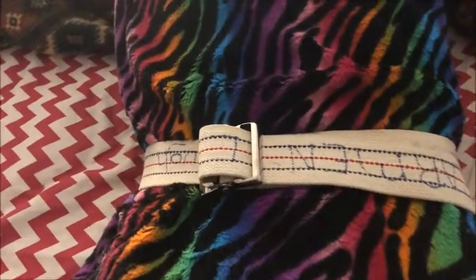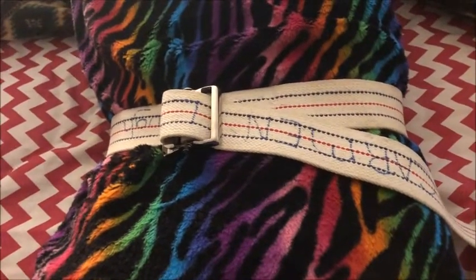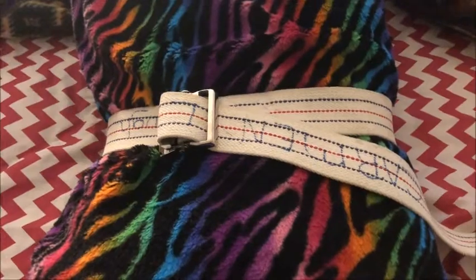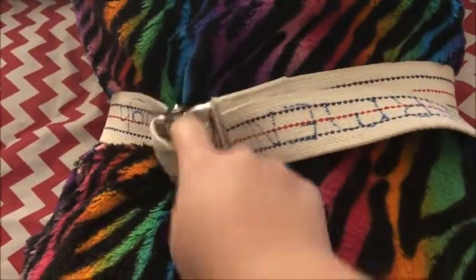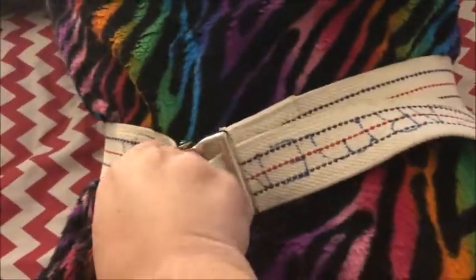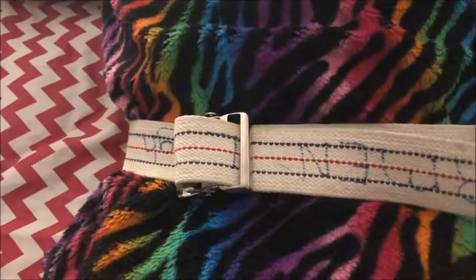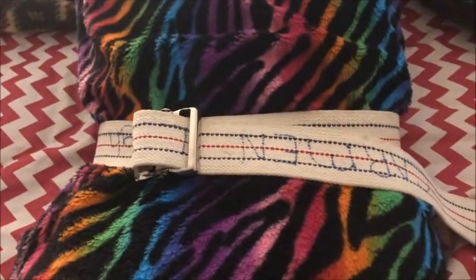This is obviously a lot easier on an actual person, so I am going to show you that — or at least try to figure out how I can show you. But this is how to do it: make that little loop and just pull it. I'll try to show you better on myself because I feel like it'll be easier to understand. Hold on, let me get set up. Okay, so let's put the gait belt on here.